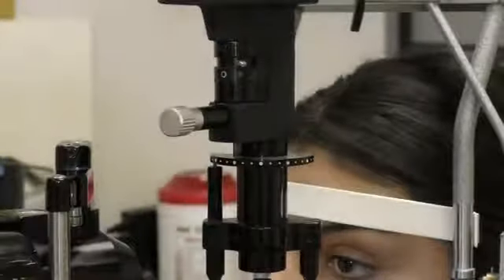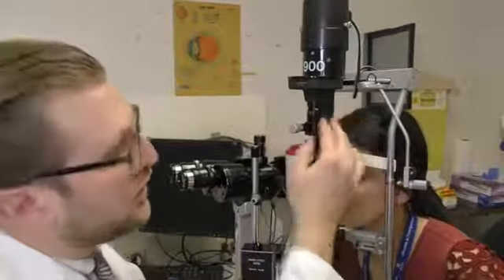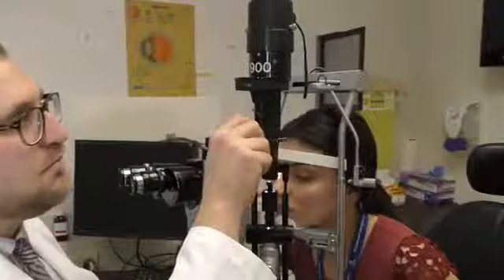So this one here has a green filter, which is our red-free filter. We tend to use a green filter, the red-free, when we're examining blood in the eye. When you put this filter on, the green filter, blood will show up black. So if you're looking for example for a microhyphema in the anterior chamber, you can use this filter to help you pick out the red blood cells. And again, if you want the blue filter, you can just put it on the normal light and then turn it all the way until it clicks, and then you have the blue filter, okay?